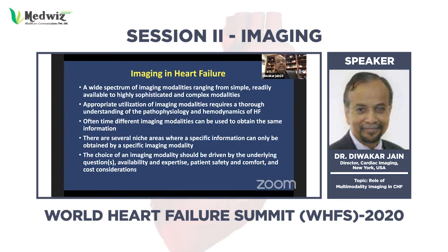So for imaging, we have a wide spectrum of imaging modalities, ranging from very simple, readily available, to highly sophisticated and complex modalities. Appropriate utilization of imaging modality requires a thorough understanding of the pathophysiology and hemodynamics of heart failure. Oftentimes, different imaging modalities can be used to obtain the same information, but there are several niche areas where specific information can only be obtained by a specific imaging modality.